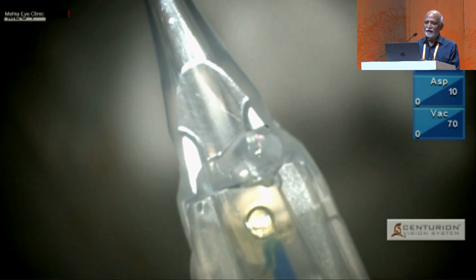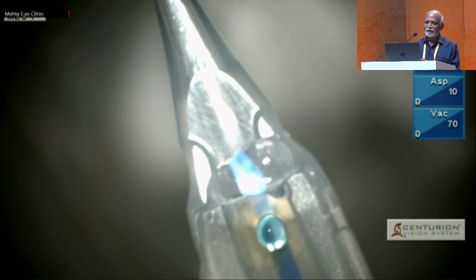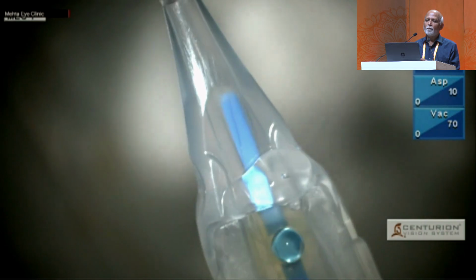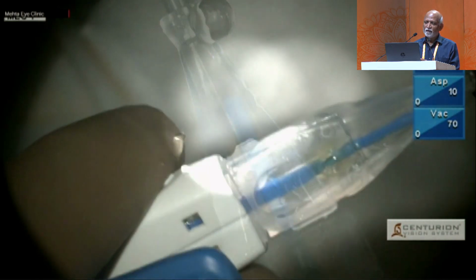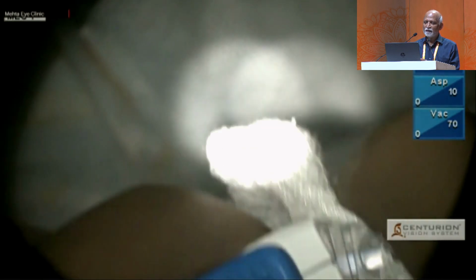And this was one with that gas syringe behind, and the plunger starts pushing the lens, but it goes above the lens and comes out. The lens is still inside. So I start wondering, what am I supposed to do? Because there's no standby lens, and the patient had insisted on this particular Clarion lens.